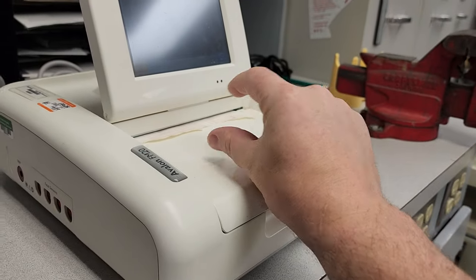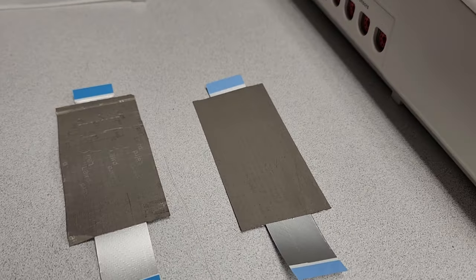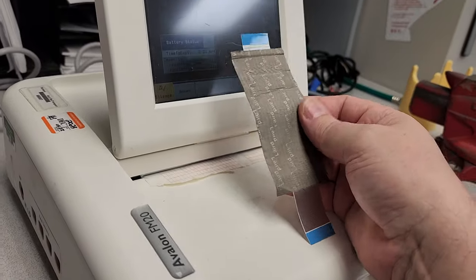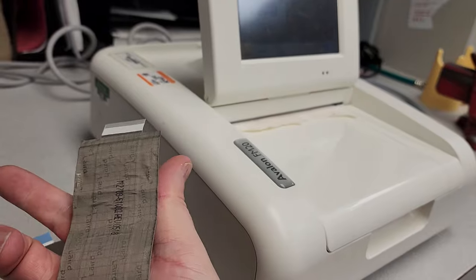Ingenious how they have the interboard connects. Fantastic. I actually love the design of a lot of Philips products. Then we come over here and we have the display cable. This is the original one, the one that came up inside here. And notice how it's got the protective shielding. Seems like that would be a very good thing, right?